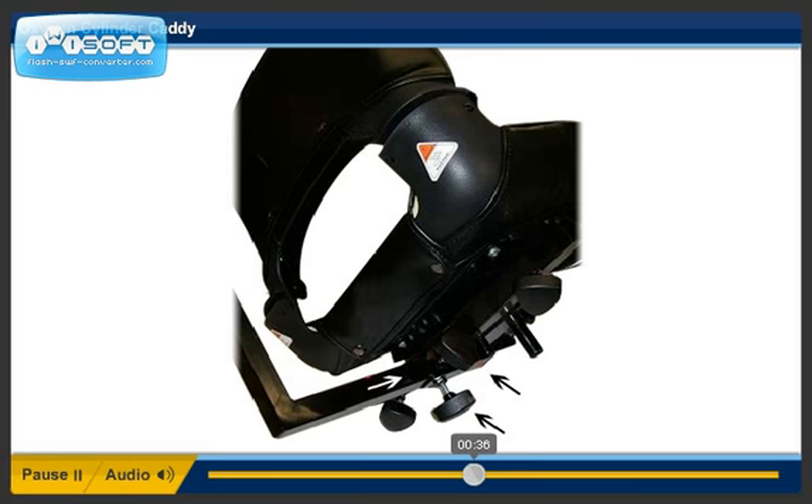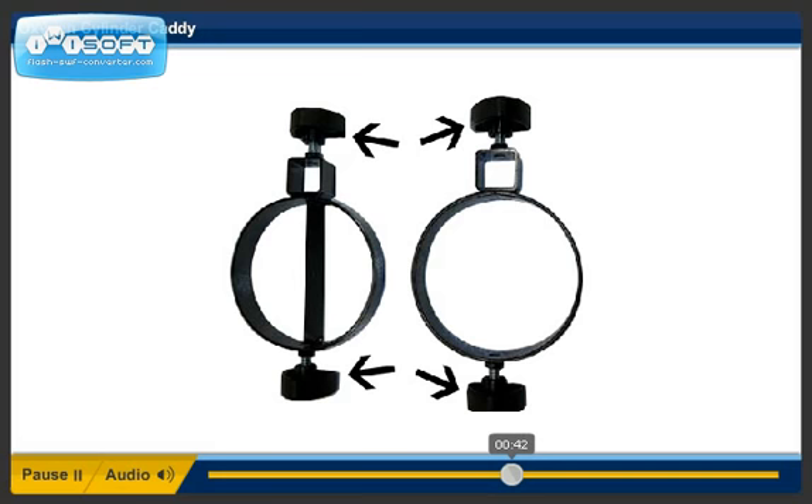Step 6. Install the four remaining knobs on the upper and the lower cylinder holders. Install the knobs about one-eighth of an inch.